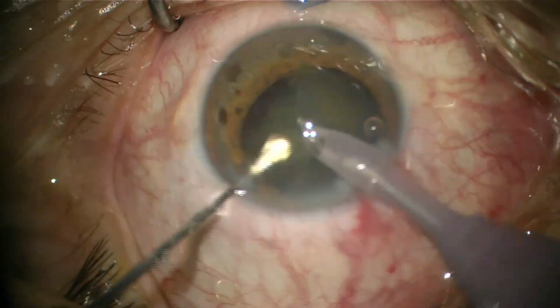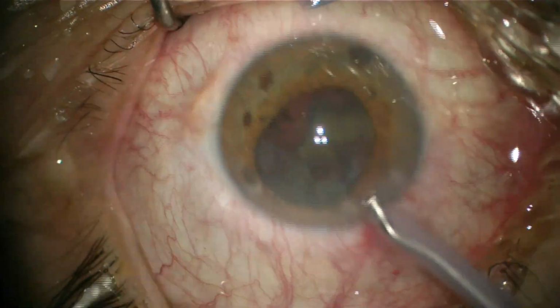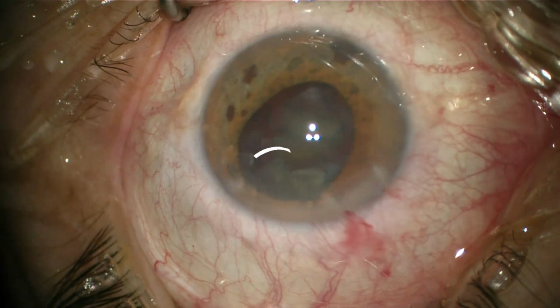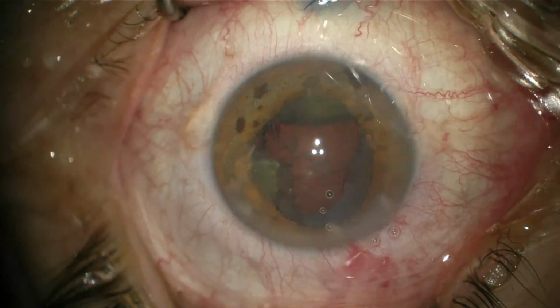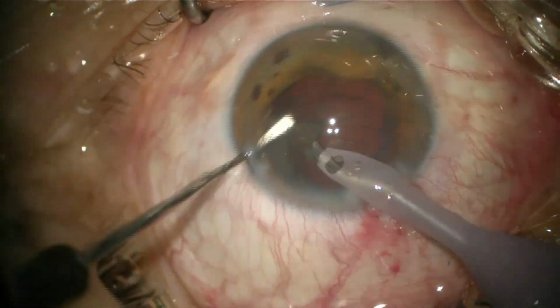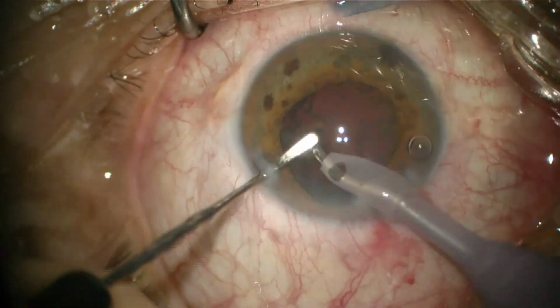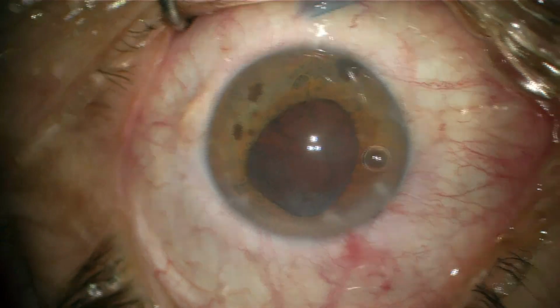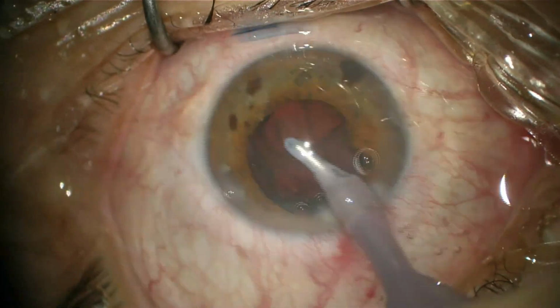You have almost completed aspirating all the fragments, but ouch, look, the iris starts to prolapse through the accessory port. When an iris starts to prolapse like this, you better start to be cautious, because this means that the iris is mad at you. And now with the irrigation aspiration probe, you start to aspirate that cortex material. And here is where you see the real IFIS.